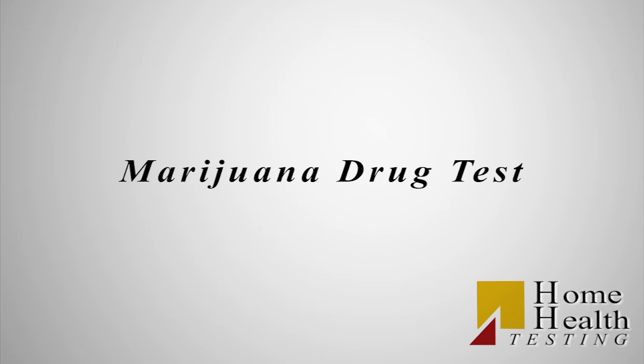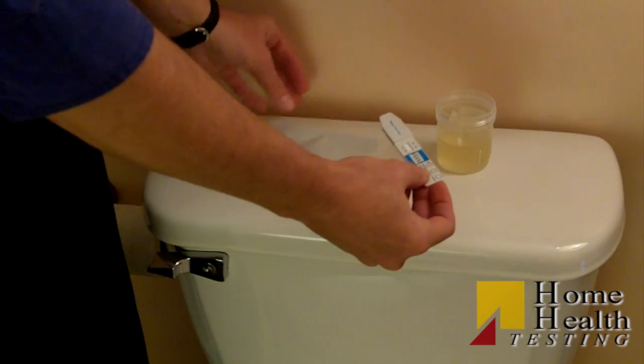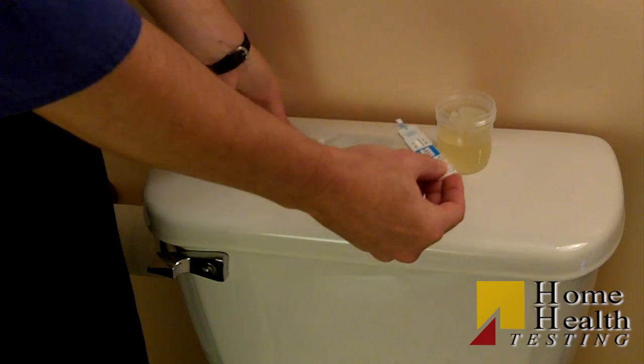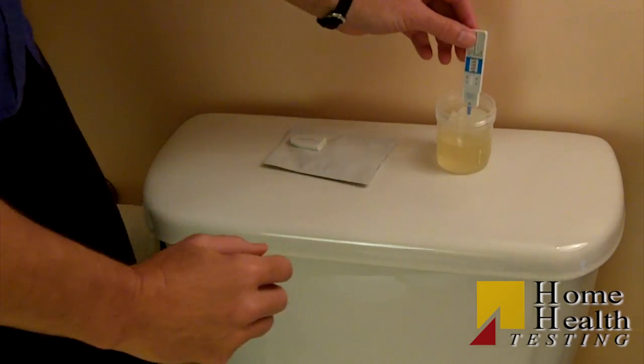I'm going to show you how to do a marijuana drug test. Allow the test card and urine specimen to come to room temperature. Remove the test card from the sealed pouch and use it as soon as possible. Remove the eye screen labeled cap from the end of the test card.